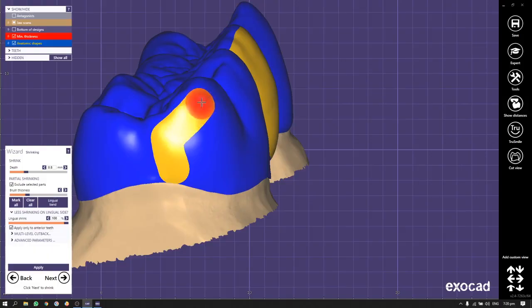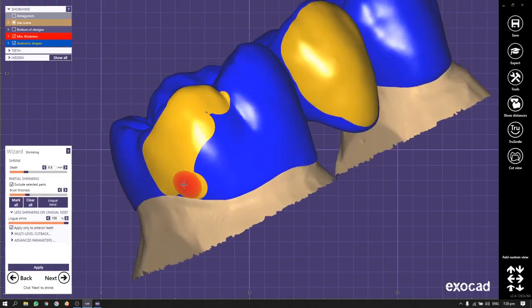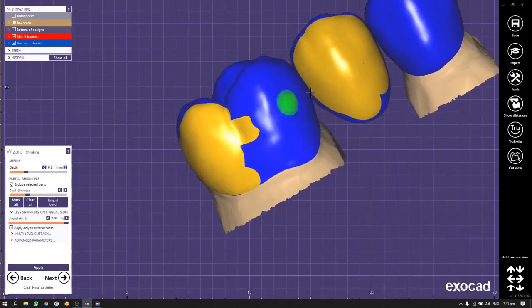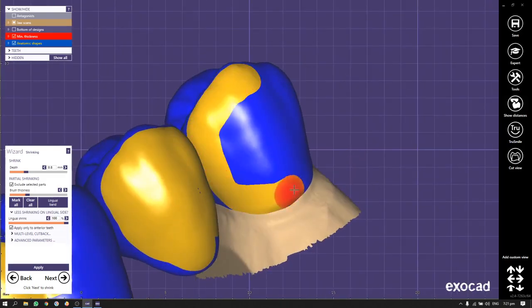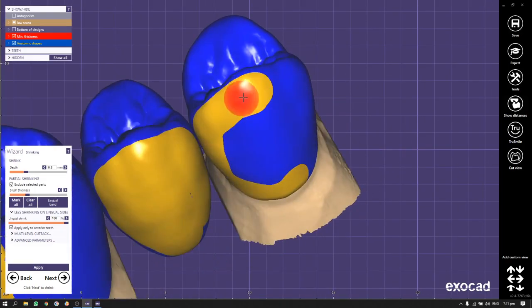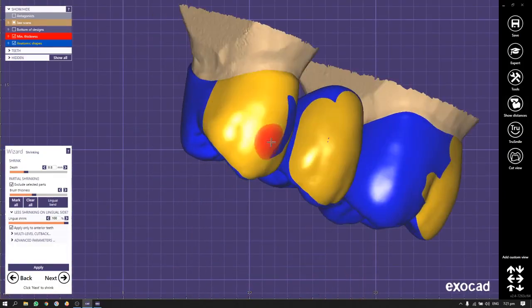I'm going a little bit on the proximal area, but I'm keeping the cusp tip, the incisal edge, because during the movement of the jaw, we won't hit with the lower jaw the transition of ceramic to the zirconia and not have chipping. So we leave this protective facet.